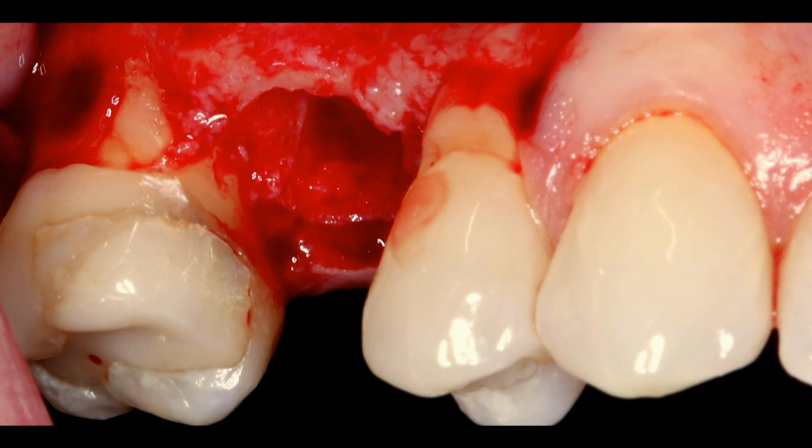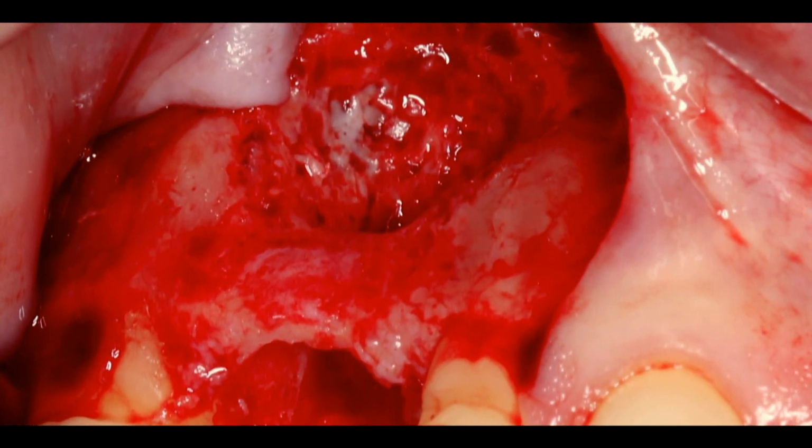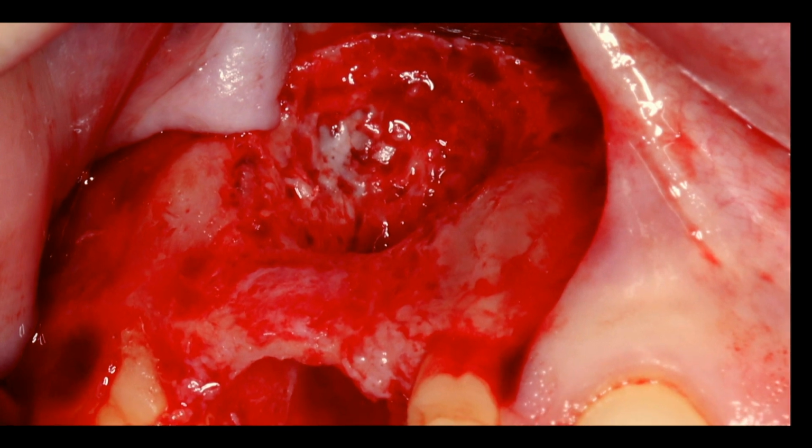And you can see here, this case, you guys are all thinking, well, why did he open it? He's telling us to do everything minimally invasive. That's not always possible. In this case, we took out the tooth, we start bone sounding, and we knew from the CT scan, but this case was just an extremely large defect here. Tremendous defect. I'm not going to do a vestibular incision for this type of case. I'm going to flap it open so I can clean this really, really well.